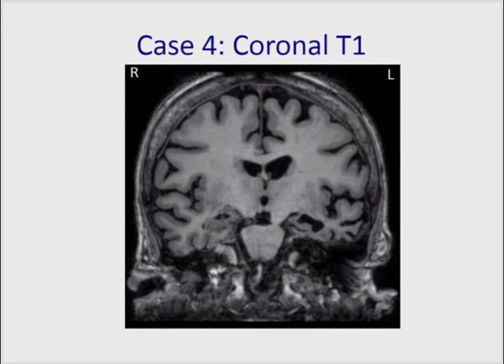So here's her structural imaging, which I think is pretty dramatic. If you look at the left temporal lobes, there's a striking atrophy that's present both medially and laterally. There is some on the opposite side as well, but it seems to be quite asymmetric on the left.